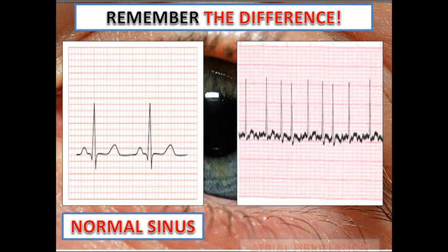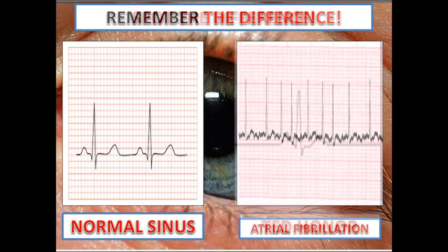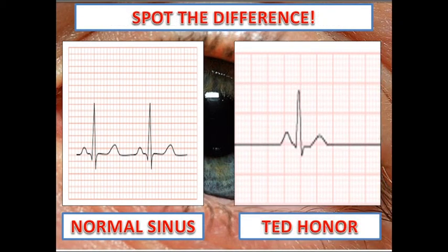There was a third patient. That's just clarifying atrial fibrillation. There was a third patient, that was Ted, bless him, Ted. You are looking at the same timestamp there.